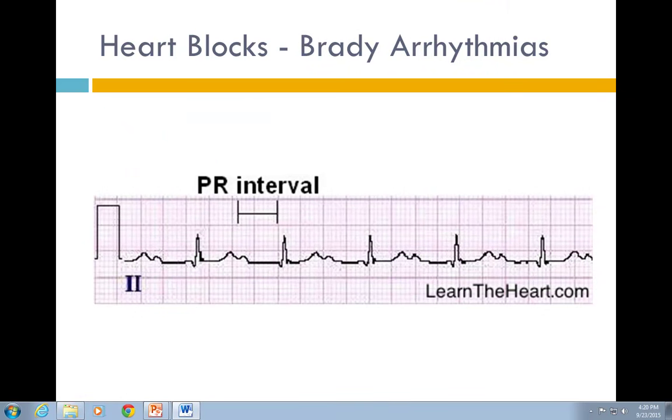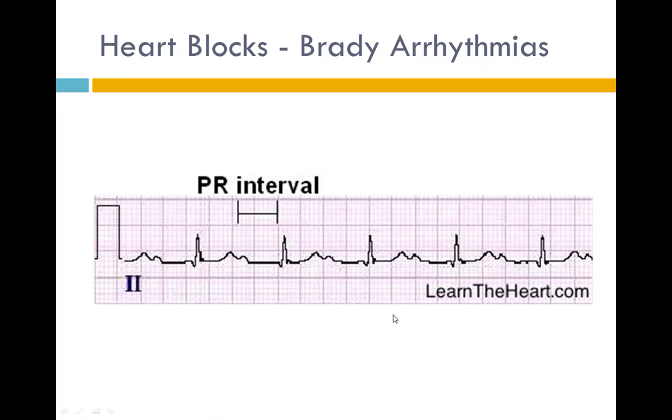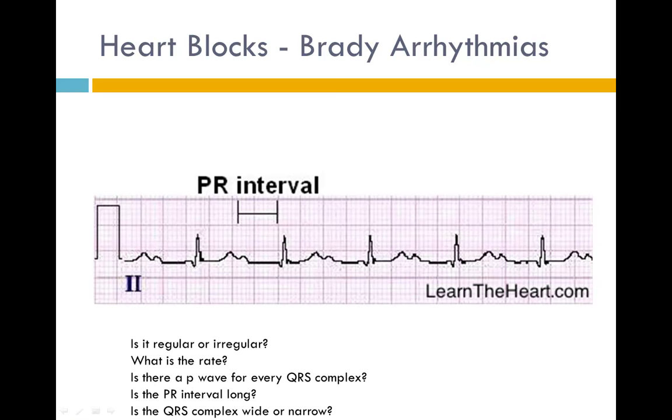All right, so heart blocks can be a challenge. I will try and make this as simple as possible. First, heart blocks are caused by conduction disturbances at that AV node. So let's start by asking, is it regular, okay? Yes, it appears regular. I see that if I was to measure out this R to R interval, they would be the same. So that is true. It is a regular rhythm.